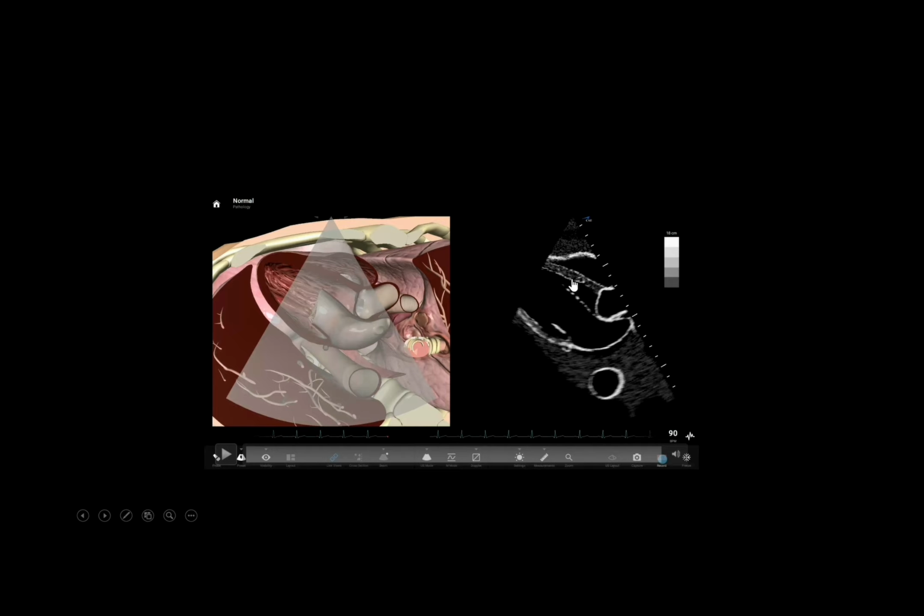You can calculate the distance between the septal wall and the mitral valve. You can also use M-mode to calculate the EPSS, which is a rough guide for your ejection fraction, but should not be used alone without visualizing your entire left ventricle.